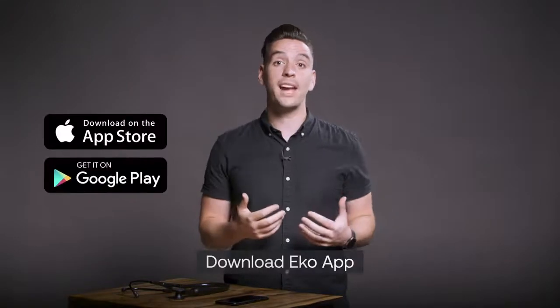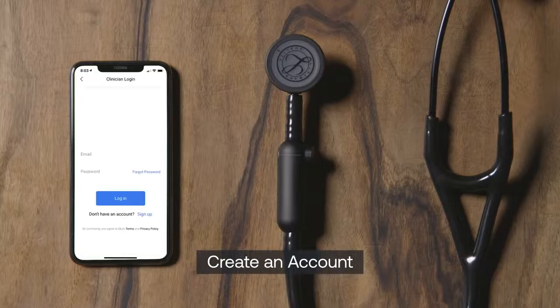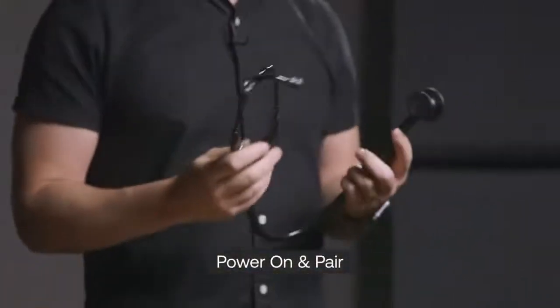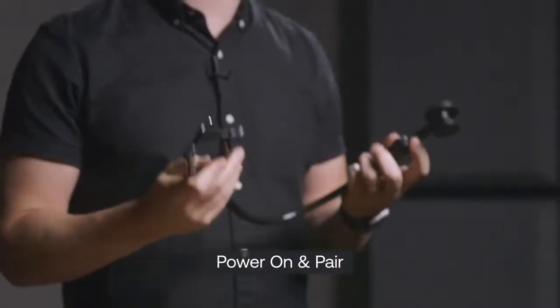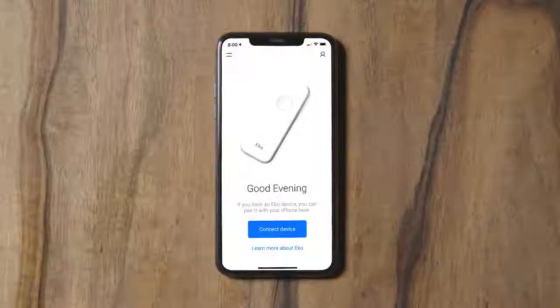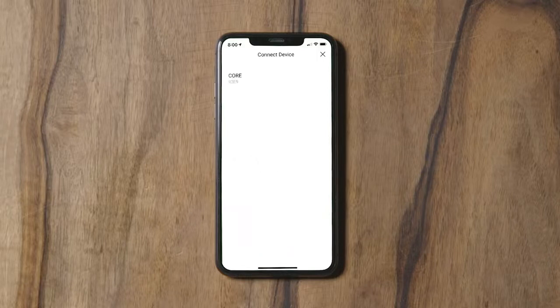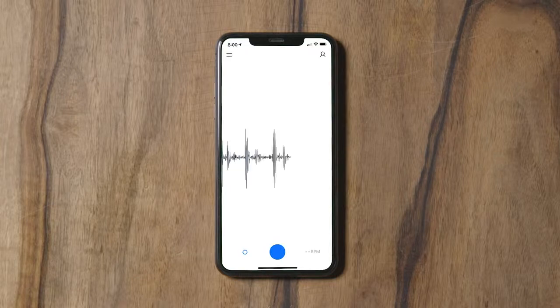Here's how to use the Eko app with your Littmann Core digital stethoscope. Download the free Eko app from the Apple and Google Play app stores. You'll be prompted to create your free secure Eko user account. Once logged in, turn on your Littmann Core digital stethoscope and pair it with the Eko app. To create a recording, begin by clicking connect device to pair the stethoscope to the app. Once connected, waveforms will begin to appear on the app. By default, your stethoscope will stay paired with the app each time you log back in.